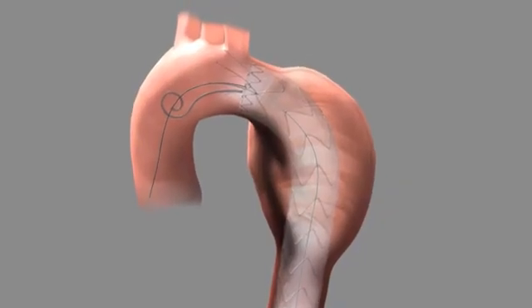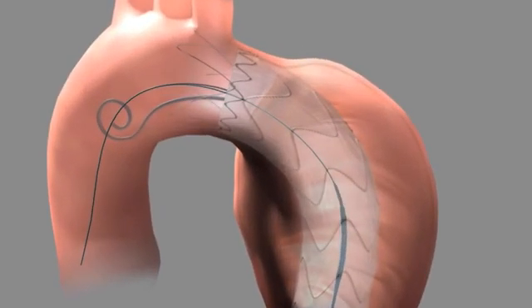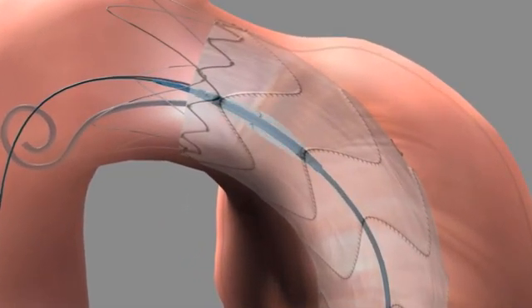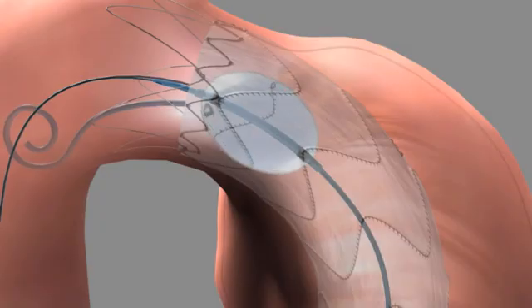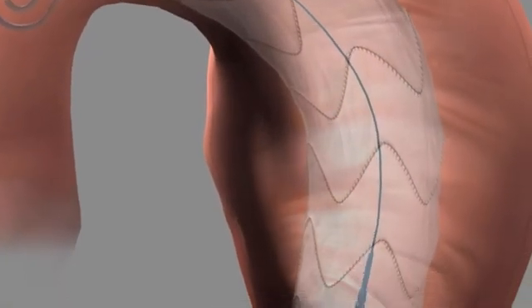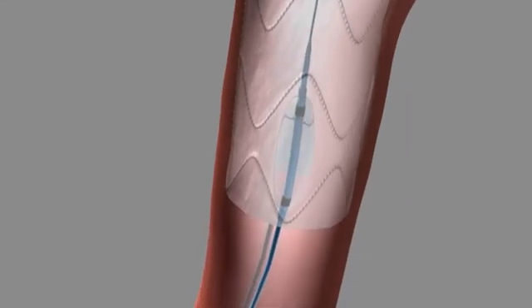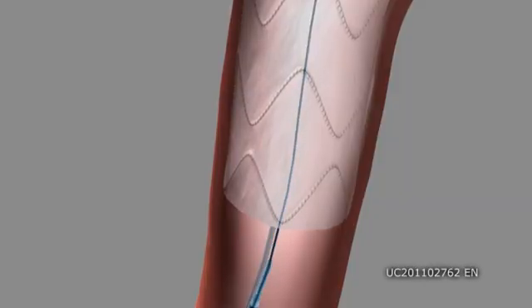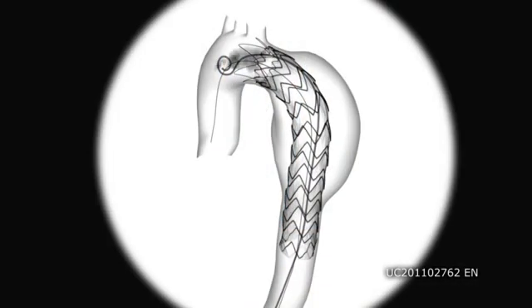Consult Reliant's instructions for use and advance the Reliant balloon over the guide wire to the target location. Inflate the Reliant balloon with contrast solution, only within the covered portion of the stent graft material. Repeat the inflations and deflations as required within the graft and remove the Reliant stent graft balloon catheter. Perform angiography to verify apposition and seal.